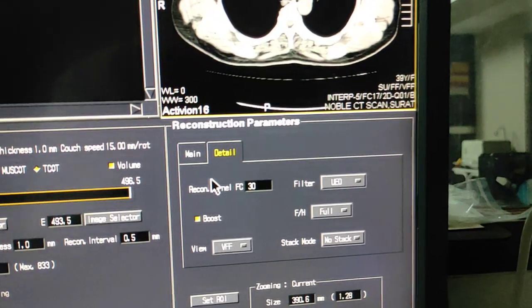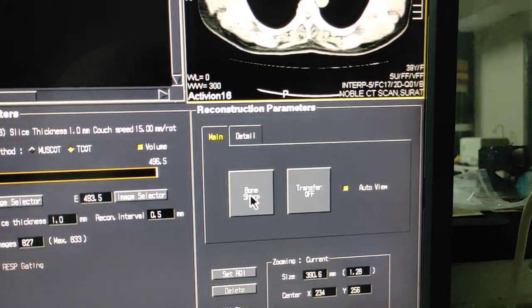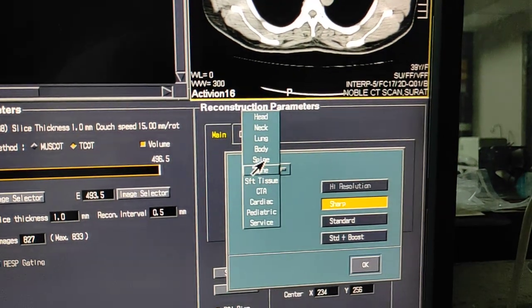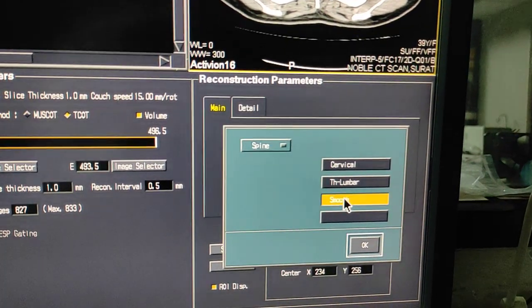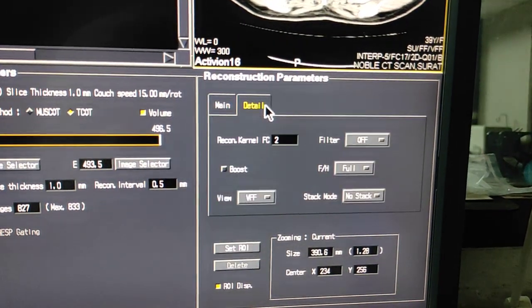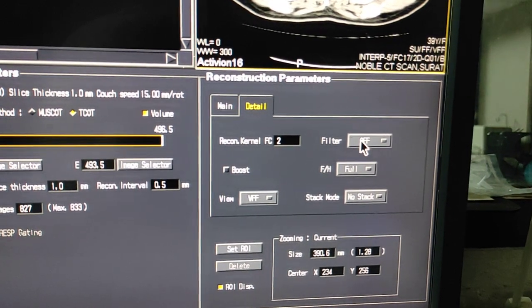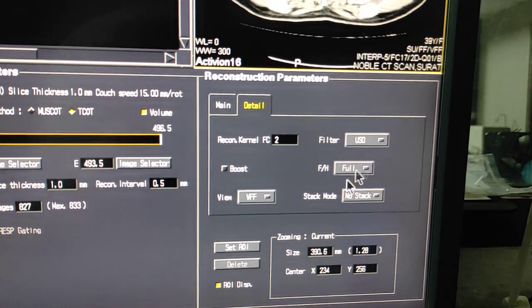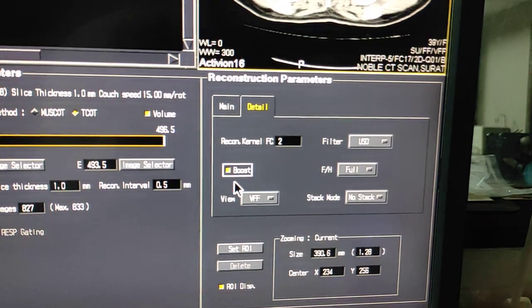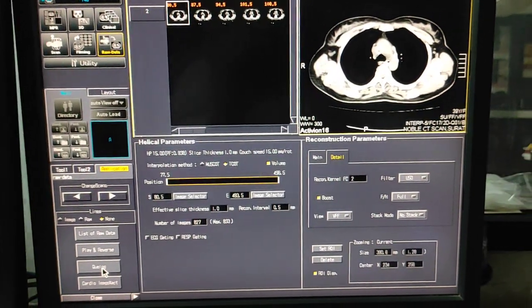Now if you want 3D for this, you have to click on main, select spine from here, then select smooth. Details: FC-2, and for the filter you have to select USO. This is the smooth recon for 3D. Click on reconstruction.